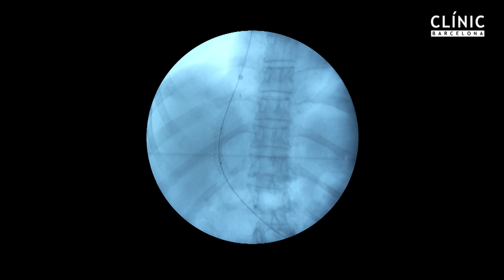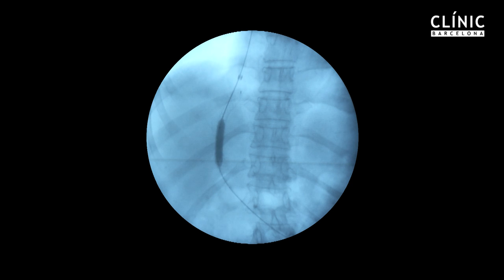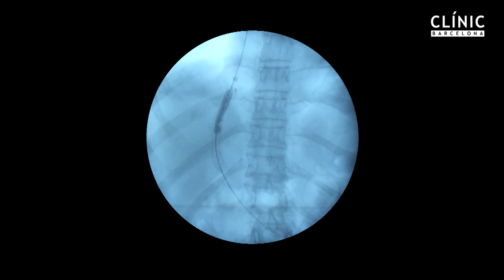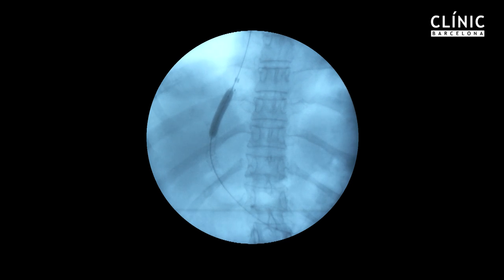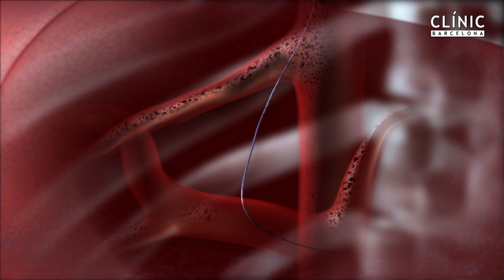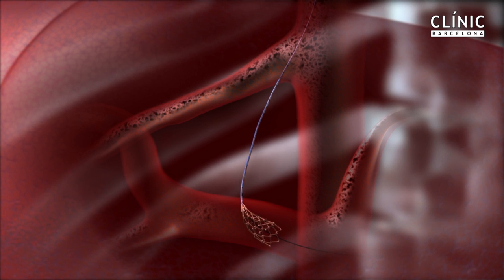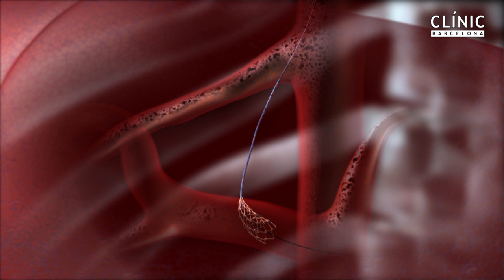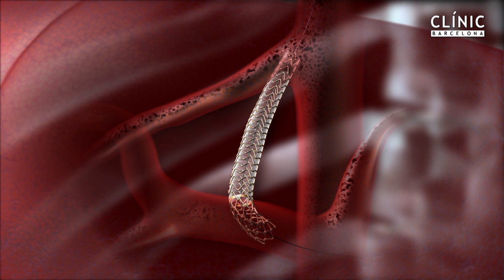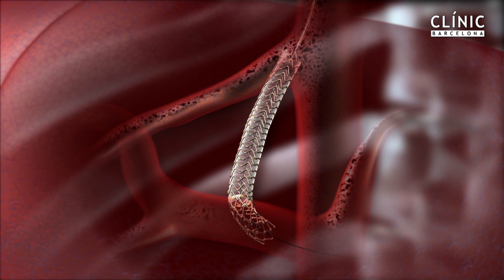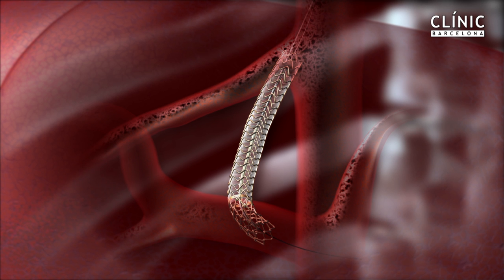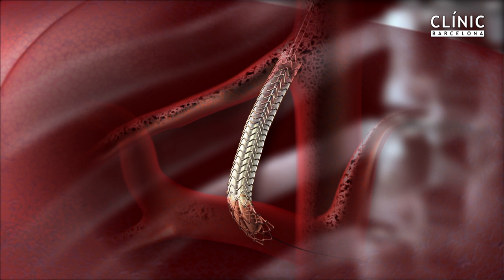After releasing the stent, it is dilated using an 8-millimeter angioplasty balloon. To review: first we deploy the uncovered part of the stent, then the deploying system is withdrawn until a small resistance is felt indicating the portal vein wall has been reached. Afterwards, the coated area is released and the stent is positioned with a new dilation of the entire track.